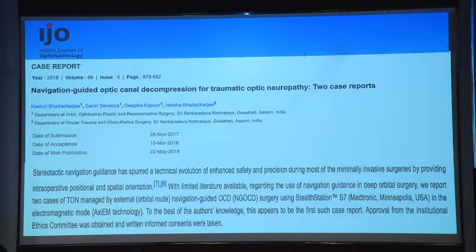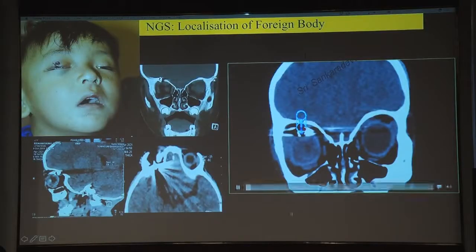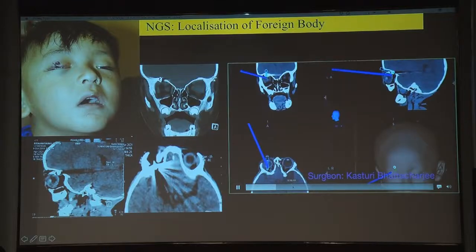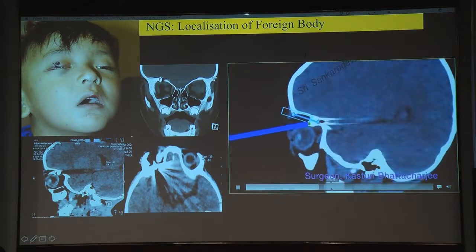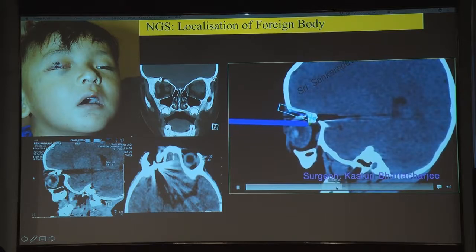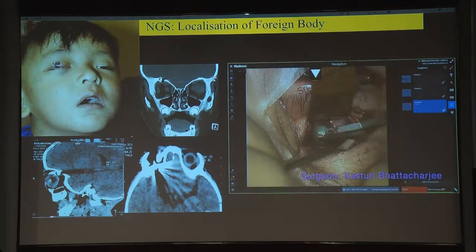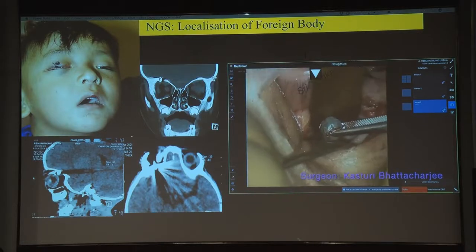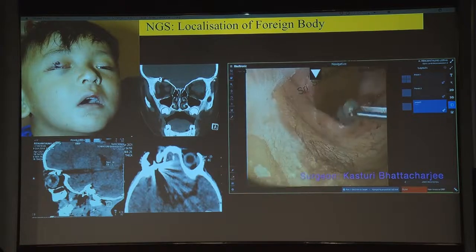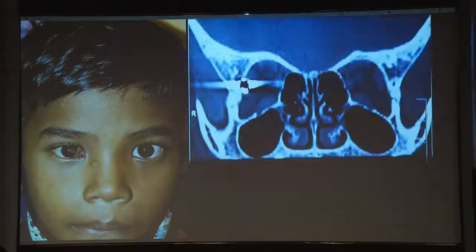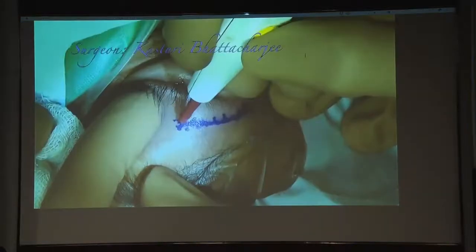Navigation is also used for removal of deep orbital foreign bodies located behind the globe. You design the point of entry and draw a cylinder trajectory; following the cylinder with minimal manipulation, you reach the foreign body while avoiding the optic nerve. One case involved a foreign body in the greater wing of the sphenoid that had been present for a long time, approached through a minimal lateral crease incision guided by navigation.